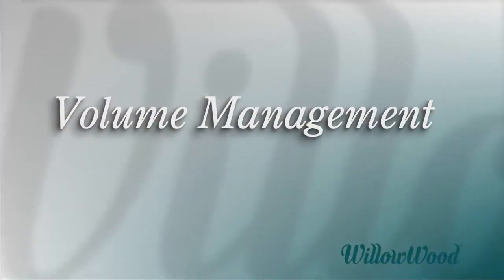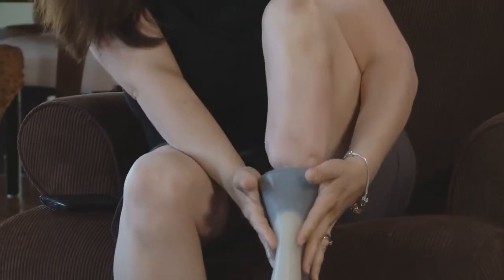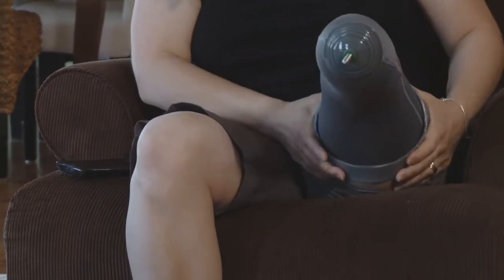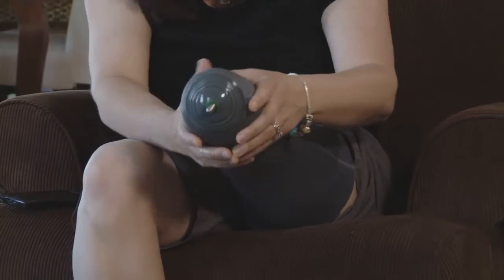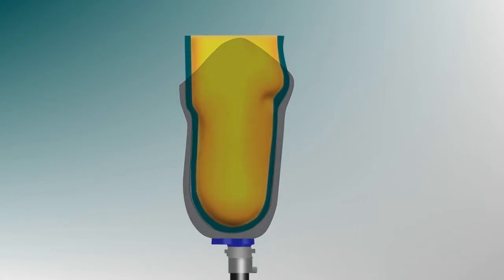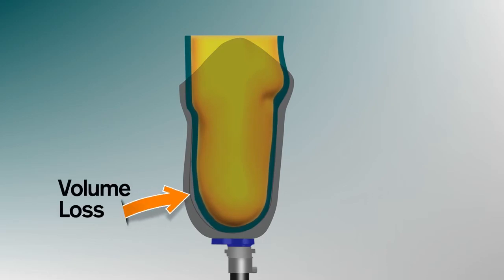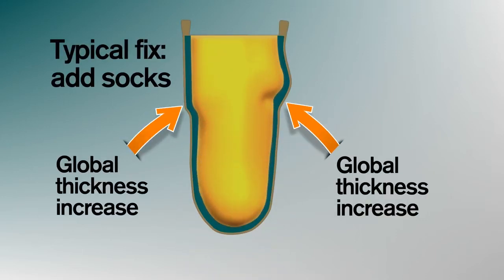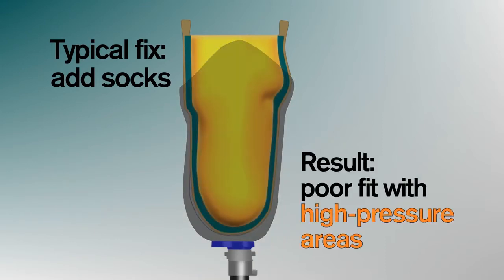A common issue for many alpha liner wearers is the daily fluctuation of residual limb volume. When volume loss occurs, your limb may move around inside of your socket, resulting in premature wear and tear of your liner. This volume loss does not happen evenly over the whole limb, however. It only occurs in the soft tissue areas, such as the area at the back of the leg in the transtibial example. If you try to compensate for this localized volume loss by adding a sock, what you are really doing is adding extra thickness over the entire limb instead of just in the area where it is needed. The result is a poor fit with high pressure in the areas where volume was not lost.